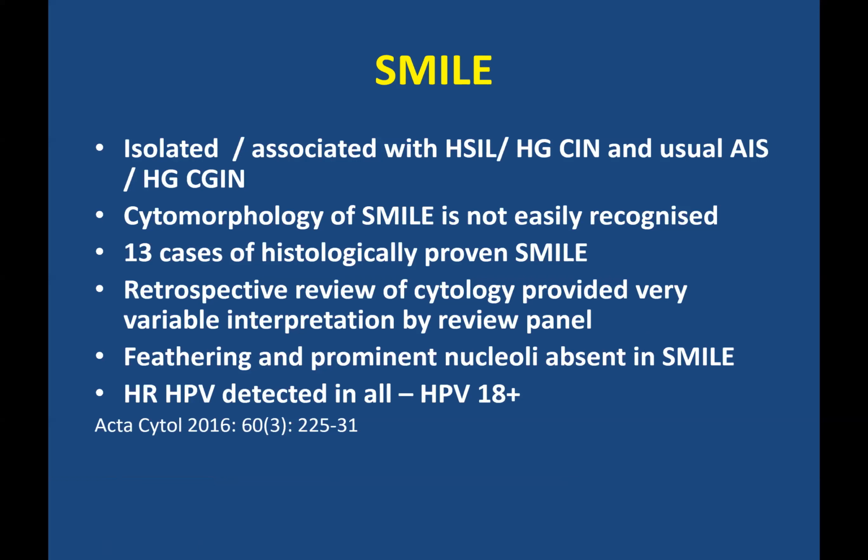This is a paper from 2016 where they looked at 13 cases of histologically proven SMILE and did a retrospective review of the cytology provided. That showed a very variable interpretation by the review panel, which I think is probably a nice way of saying that nobody could really agree. In SMILE, they did state that in these 13 cases, feathering and prominent nucleoli were absent, and high-risk HPV was detected in all, typically high-risk HPV 18.